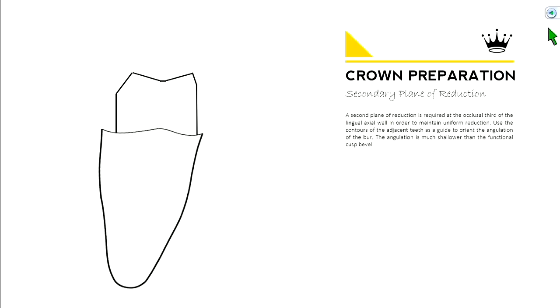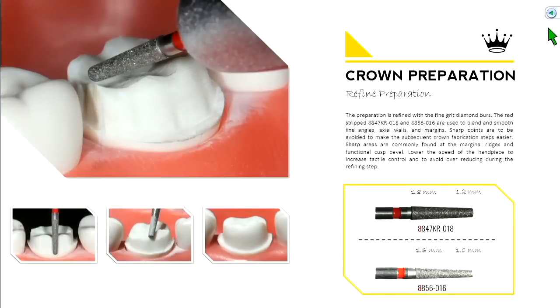Now we have the outline of our preparation. From here on out, we're really just going to refine and smooth out the prep, keeping the same contours. Whatever orientation you held your burr in, hold it the same way with a different grit. The two main burr types for refinement have an '8' in front instead of '6,' meaning fine diamond — you can slow down the handpiece for much better tactile control.